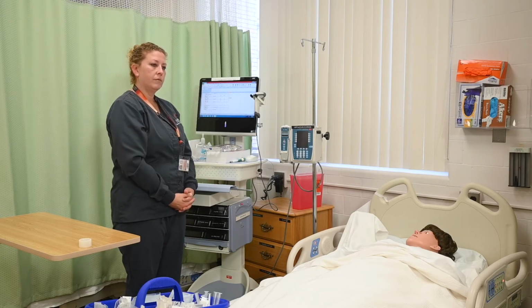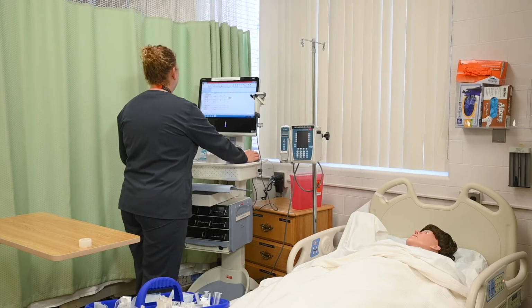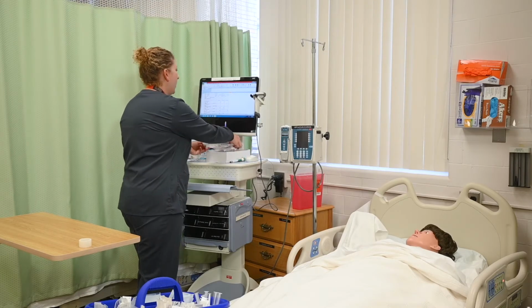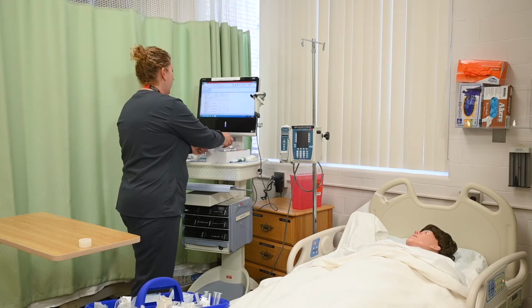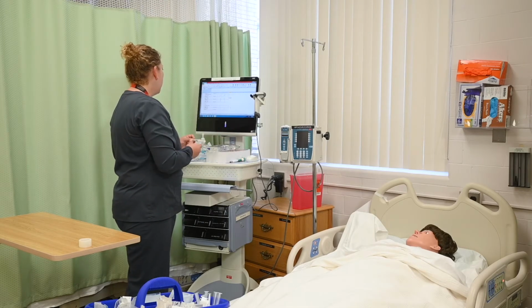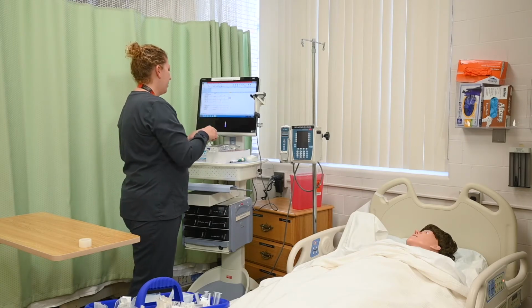She will now perform the third check of the 5 rights of medication administration of both the IV solution and the normal saline flush, comparing to the MAR. I have IV practice, date of birth 3/3/87. 0.9 sodium chloride, 100 mLs per hour IV infusion. I have 0.9 sodium chloride IV fluid. 0.9 sodium chloride, 3 to 10 mLs IV PRN flush, and I have 0.9 sodium chloride flush.